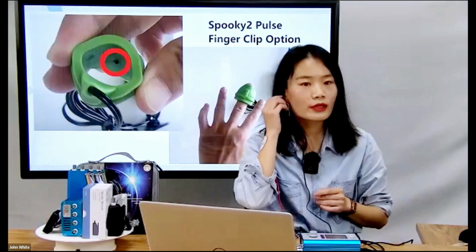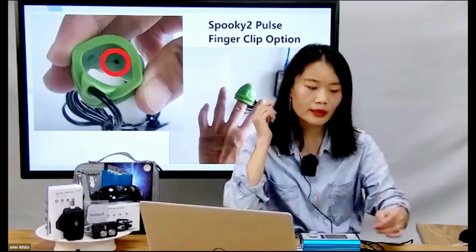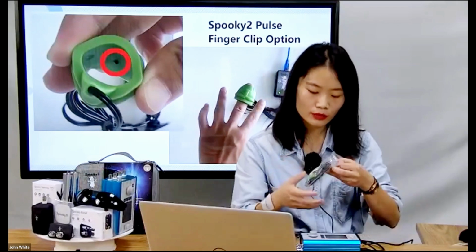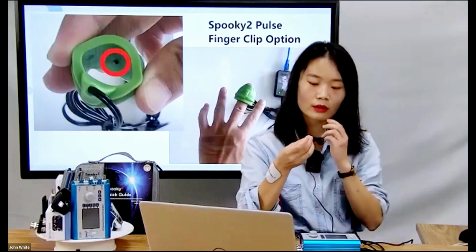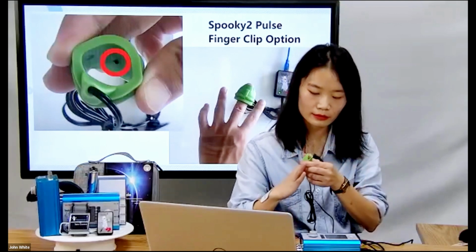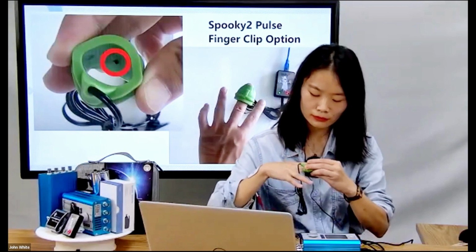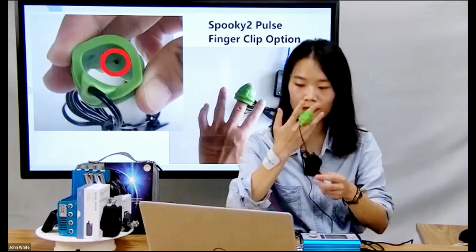And here I use a finger clip as a connection option to my body. I can also use the ear clip, and I can also use the finger clip, this one. So it's basically the same. One end goes to the pulse and the other end goes to my fingers. Like this.